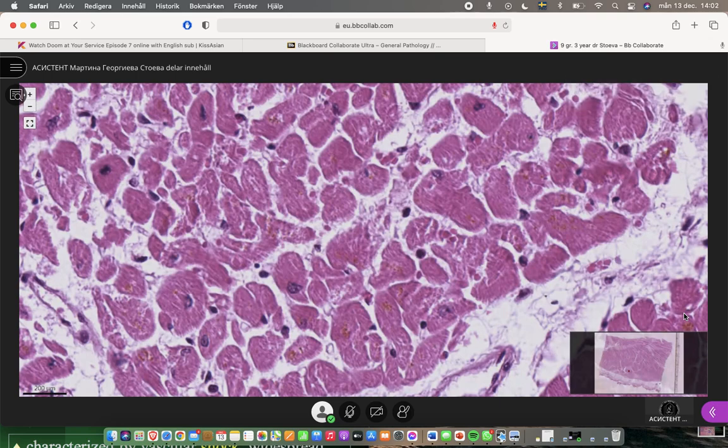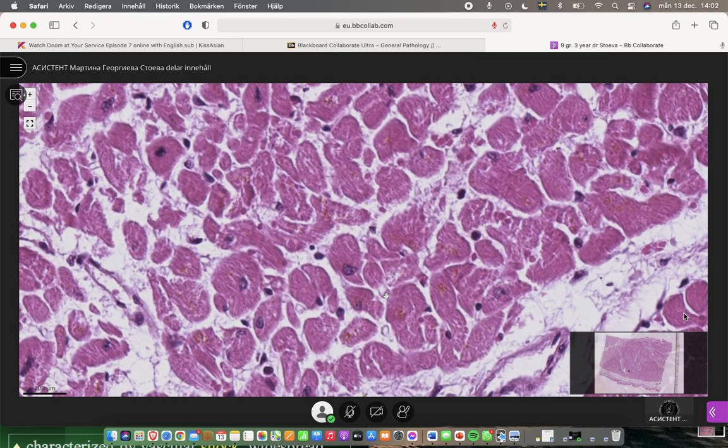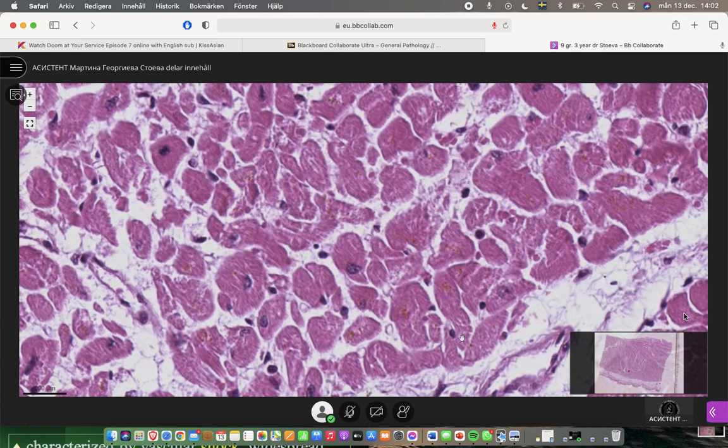23. Fibrinous pericarditis is the name of the slide. So because of the cut section that is transversal or a little bit oblique, that's why in some cases the cut section could be not through the nucleus. That's why we can't see it. But otherwise you can compare the cytoplasm of cells that contain their nuclei, and it looks exactly the same way.